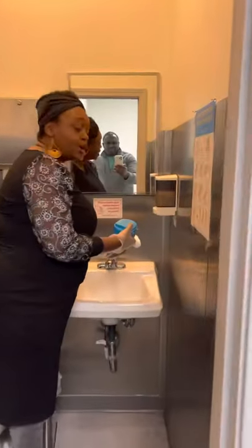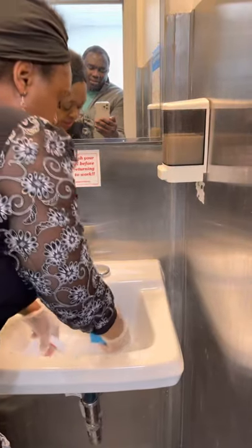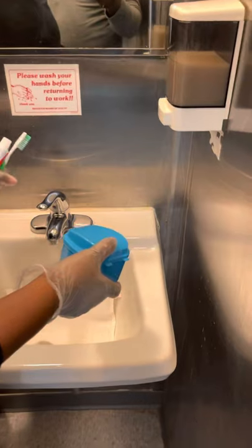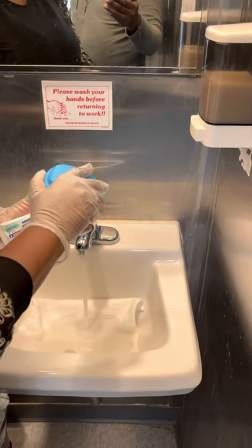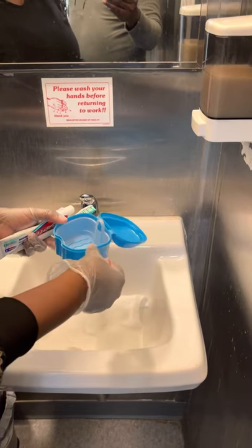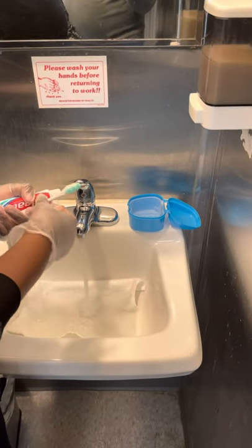All right, so with the sink here, you want to make sure that you line the sink with the washcloth just in case you drop the dentures, so that they do not break. You're going to use cold, tepid water, cool, okay? And so I've opened and I have my dentures. I'm just going to place my denture cup. Your evaluator probably will have maybe a table or something like that nearby.